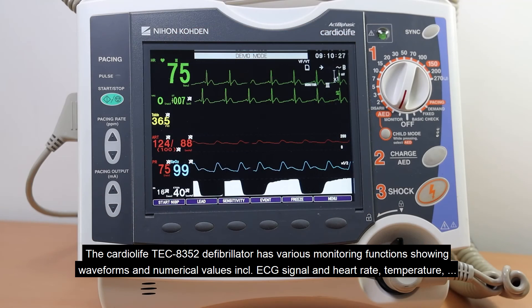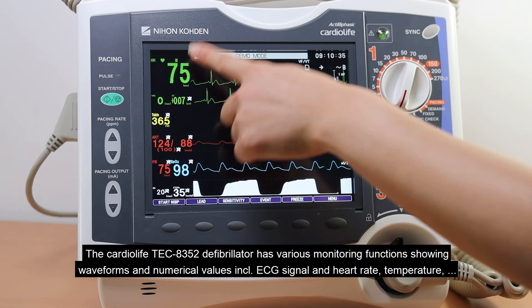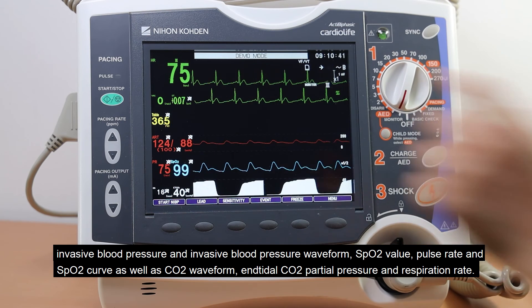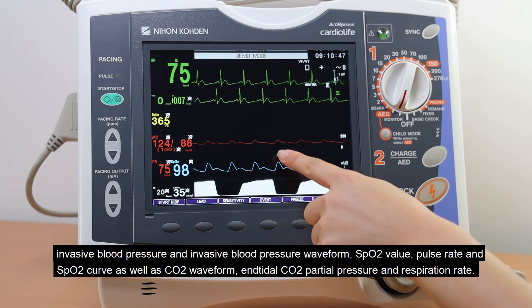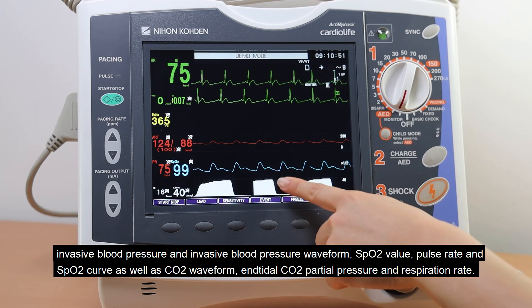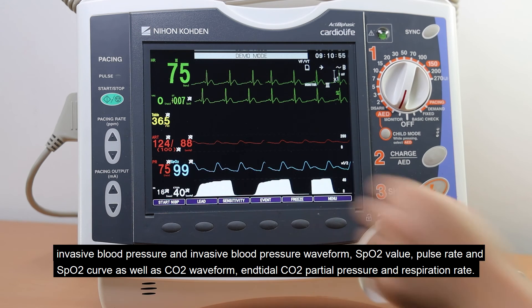The CardioLife TEC-8352 defibrillator has various monitoring functions showing waveforms and numerical values, including ECG signal and heart rate, temperature, pressure, invasive blood pressure and waveform, SpO2 value, pulse rate, and SpO2 curve, as well as CO2 waveform, end-tidal CO2 partial pressure, and respiration rate.